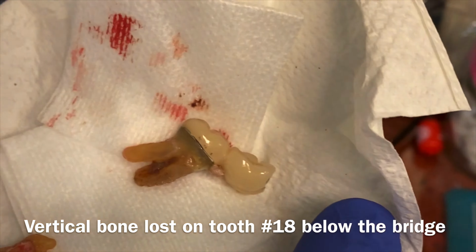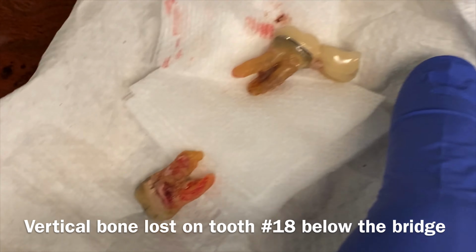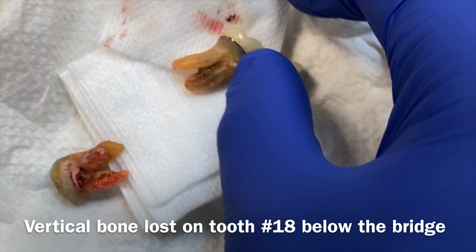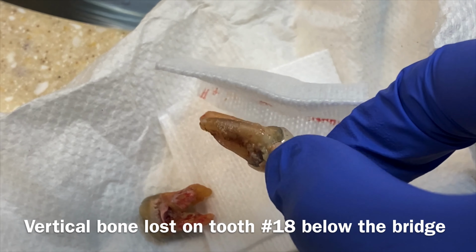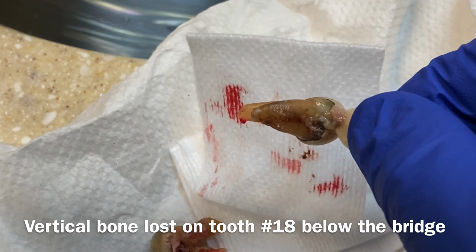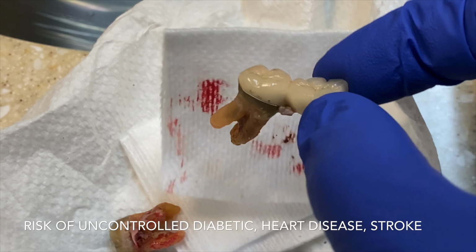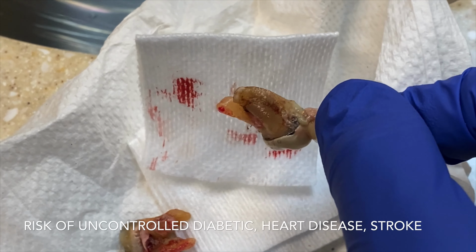Yeah, here's the removal of the bridge once I cut it out, and you can see that it's pretty bad looking here. Bridge cut out, and look how dirty it is underneath. The patient cannot maintain it daily, and imagine how this is going to affect her systemic body. Diabetes, heart disease, all kinds of stuff can be related to bacterial infection.